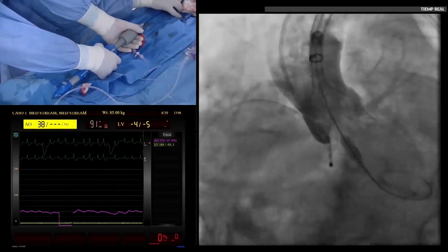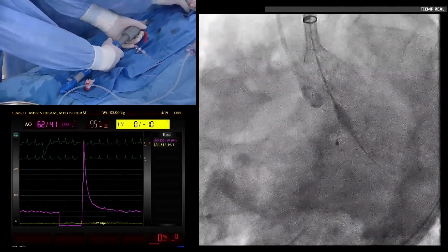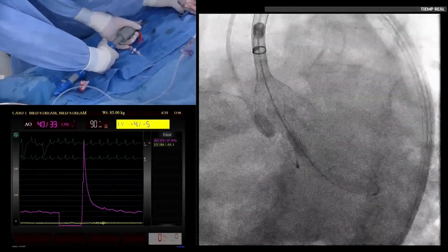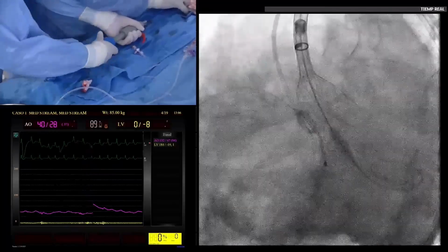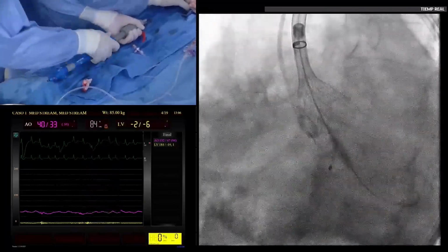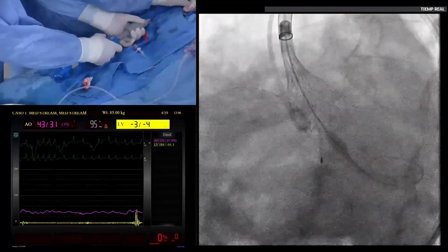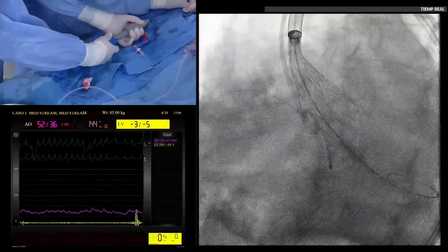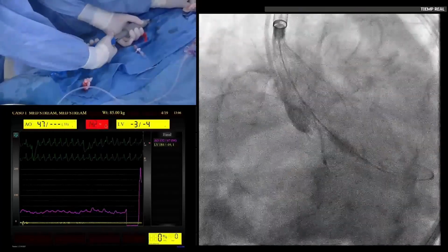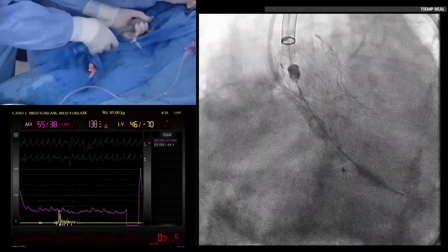Test. Okay, I think the position is okay. Show me higher up. Mark the step back and let's go, slowly. Yes, 140, I will push, don't pull. Okay, let's go. Slowly, very slowly. Test. Okay, we are okay. Now, fast. Okay. Perfect.